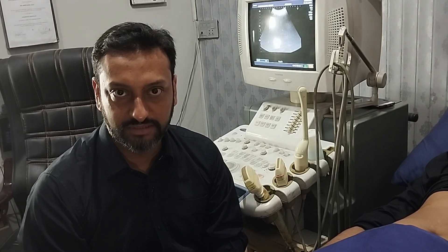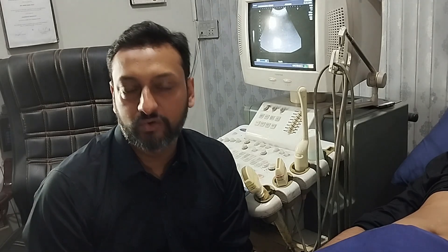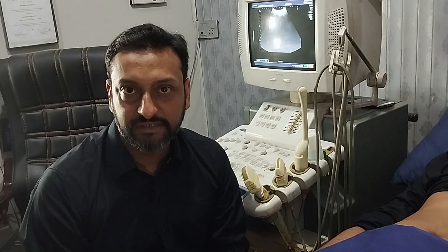Dear viewers, I'm Dr. Adil Rayaz, Consultant Radiologist at Elias Medicare & Diagnostics Center. Today we are here with the final episode of our Abdominal Ultrasound Series. With this we are coming to an end of the abdominal ultrasound course. In the next episode I'm going to start the Pelvic Ultrasound and then we will move to the Obstetrical Ultrasound. In this episode we are going to compile all our previous episodes and I'm going to teach you how to perform a complete abdominal ultrasound in five to ten minutes in a professional, efficient manner.